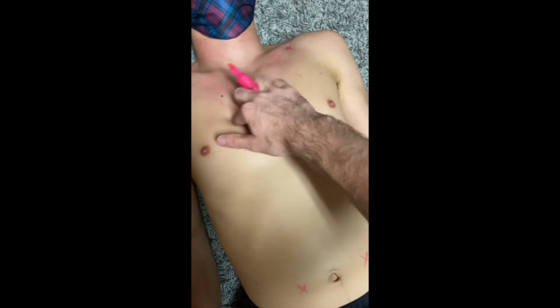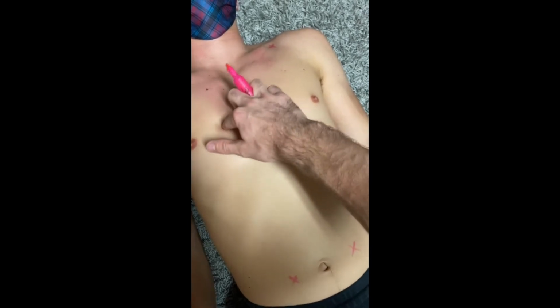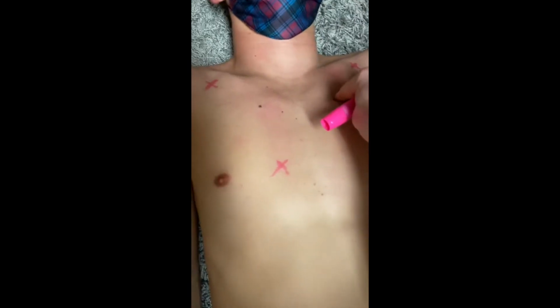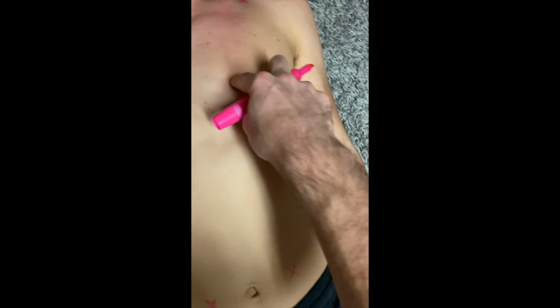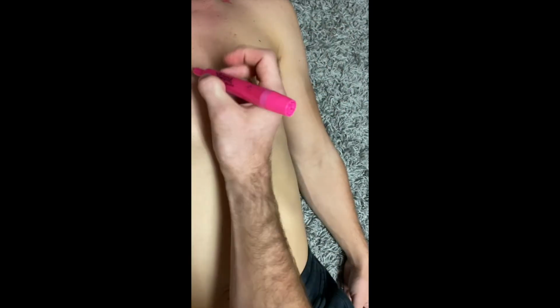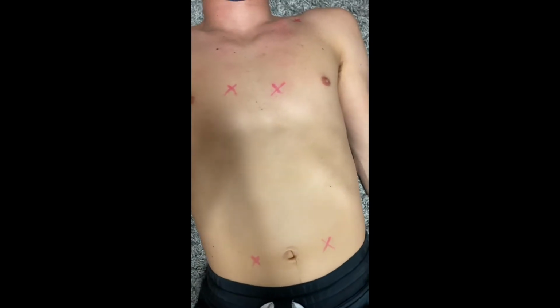2, 3, 4, right there. All right, and then I can feel same thing on the other side. So boom, there's one, there's another one, and there we go. There's the 4th space right there. There we go. All right, so that's V1 and V2.